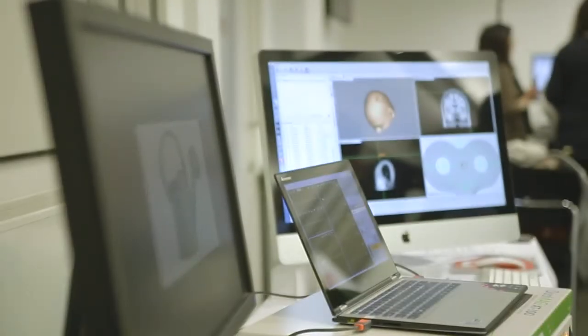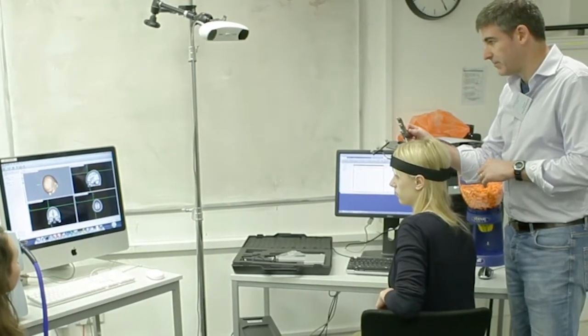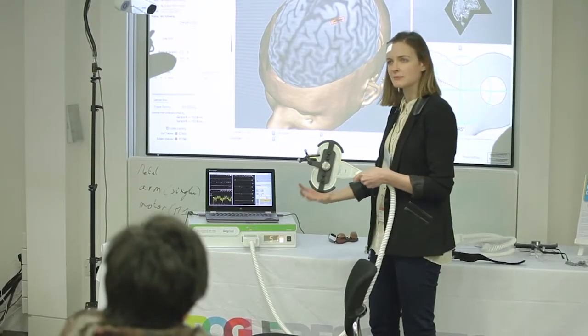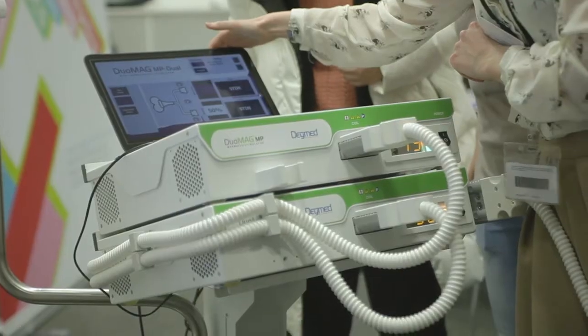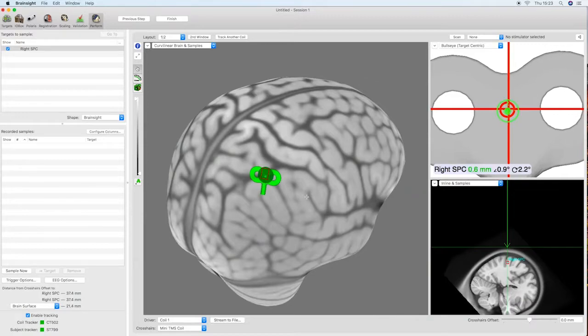Hello and welcome to this Brainsight tutorial. In this video we will demonstrate how to use Brainsight to visualize a scalp location that corresponds to the location of x, y and z coordinates within the brain.